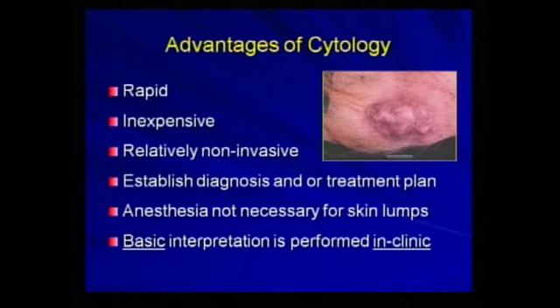My hope in giving this lecture is to give you some basic concepts, to look at some of the lesions that I believe anatomic pathologists and pathology residents should be able to diagnose fairly easily. It is certainly not a substitute for a good background in cytology.